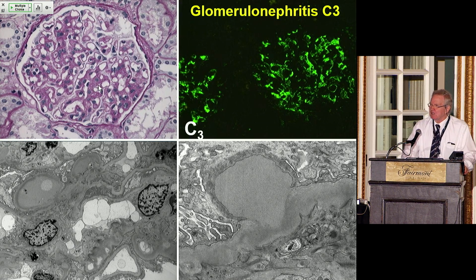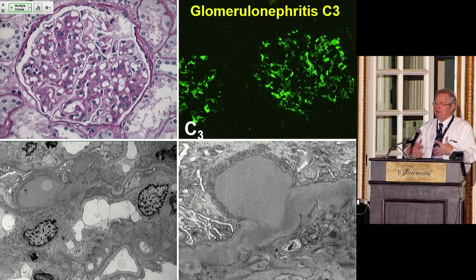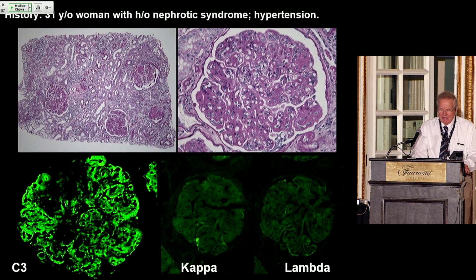If you were to biopsy this patient with a flare-up of this disease right after an infection that triggers this, you will find a membranoproliferative pattern, or mesangiocapillary, depending on which side of the Atlantic you live. Complement is the only marker that is there by immunofluorescence. No IgG, no significant IgA, no IgM, and then these odd deposits. So in a classic fashion, you recognize them very easily.